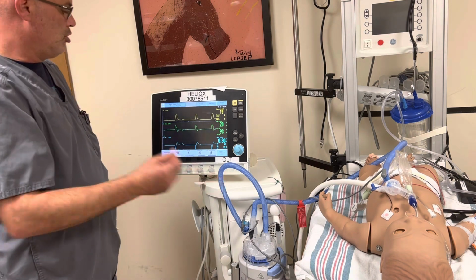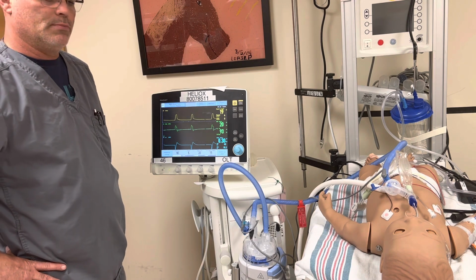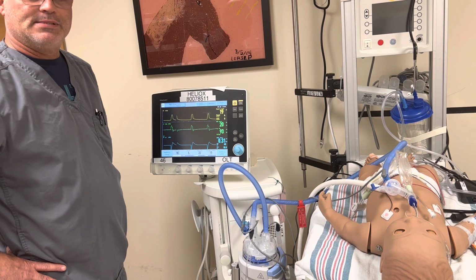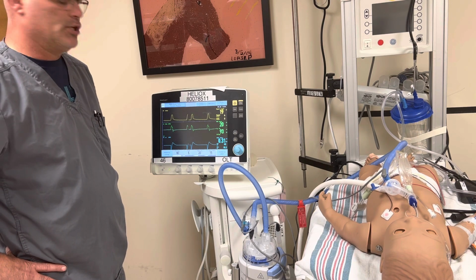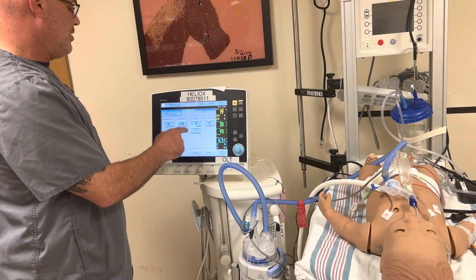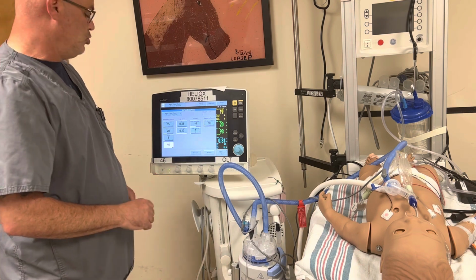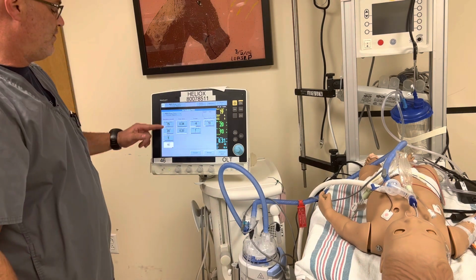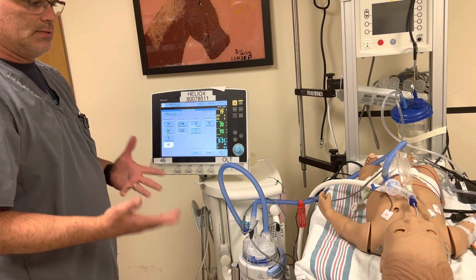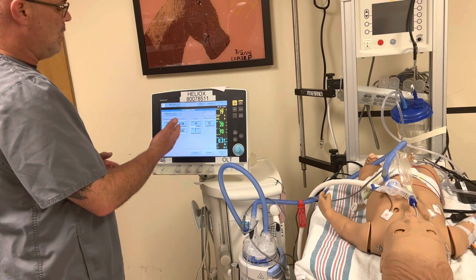So this patient currently, we intubated just now, and the doctor's order was to put him on 20/5 with a rate of 20, keep stats greater than 92, and pressure support of 10. So we would initially go in and we would have to set those orders as he had ordered to, that he had told you. So we have here on the servo 20/5 with a rate of 20. Now we have the O2 set at 90 just because that's what this particular situation is calling for, because he wanted sat greater than 92.